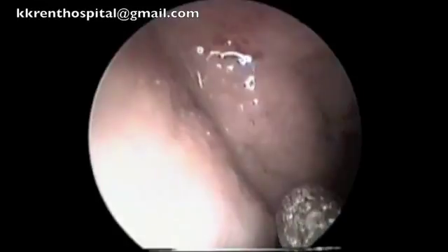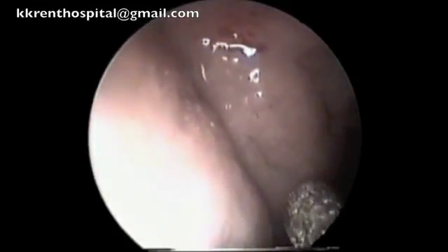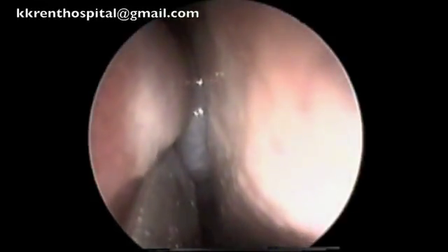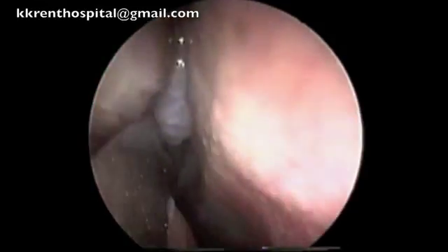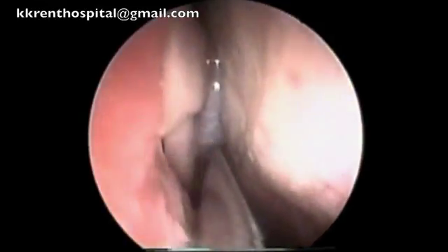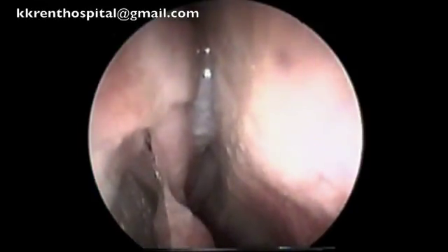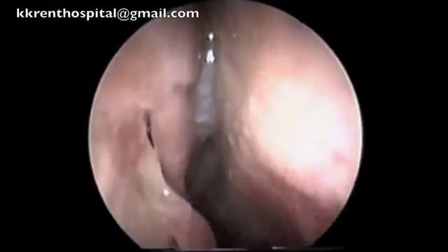The endoscopy is continued and you can actually see the prolapsed arachnoid, which is seen medial to the middle turbinate, between the middle turbinate and the nasal septum. The middle meatus is also visible.